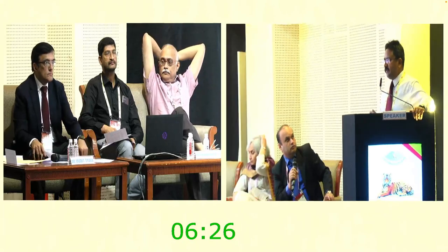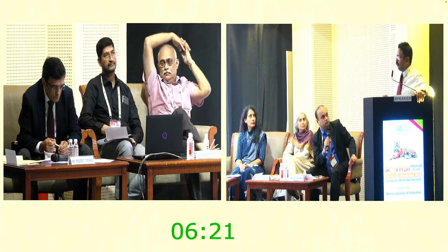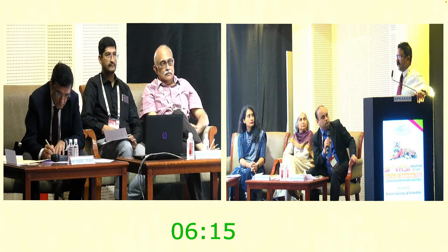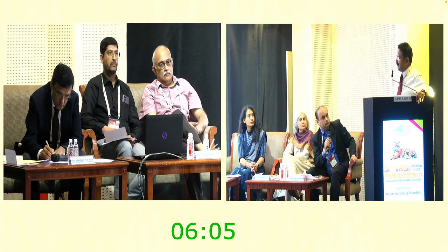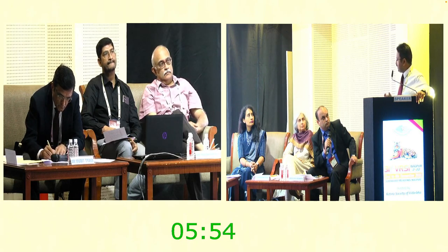How does the Vicryl help in this? Basically to stop slippage, or is it helping? Yes, sir. Actually, when Dr. Yamane described his technique, he used a 30 gauge needle with an inner bore large enough to accommodate the haptic of the IOL. However, in India, at least I could not find any 30 gauge needle through which I can pass the haptic through that lumen. Maybe in Japan that needle is available wherein the inner diameter accommodates the haptic. So we are using a 26 gauge needle, and the flange which we make, sometimes if we manipulate more on the other side, it can just retract inside.